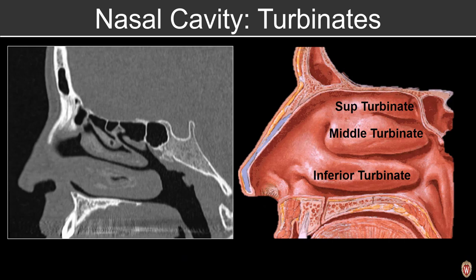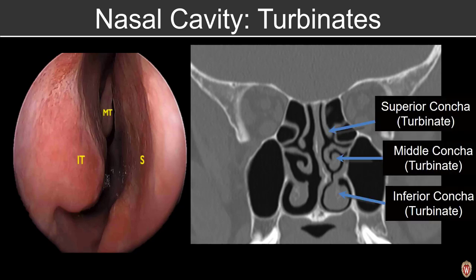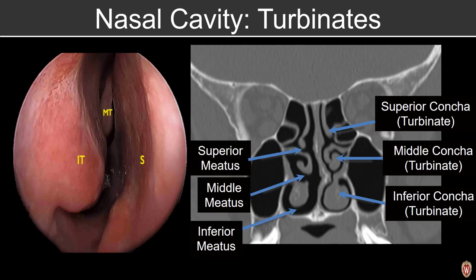On either side of the nasal septum, we see three paired turbinates, which help filter the air we breathe. On our coronal view, we can see these three paired turbinates — the superior, middle, and inferior turbinate. Subjacent to the turbinates are the air spaces referred to as the superior, middle, and inferior meatus, which drain various structures within the sinonasal cavity.